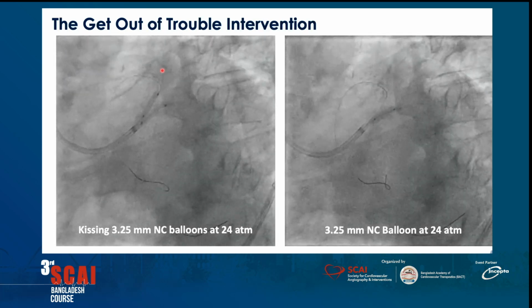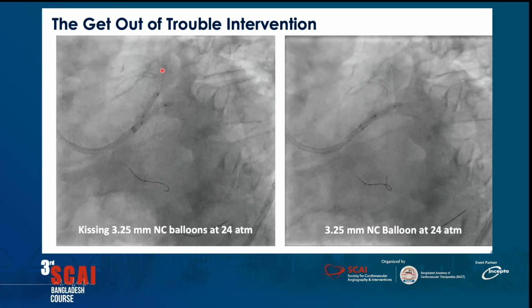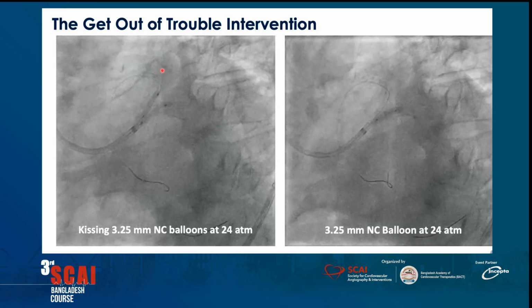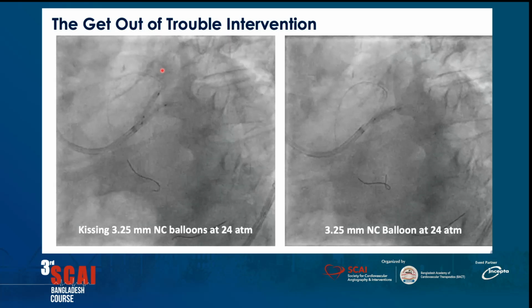So one of the operators at our institution, when this guy was sitting on the ward for 4 or 5 days, now getting chest pain at rest, went in and did a, quote, get out of trouble intervention. As you notice, there wasn't much in the way of a left main. So this is the one circumstance where maybe an SKS type approach is a reasonable approach as a bailout in this patient with no left main.